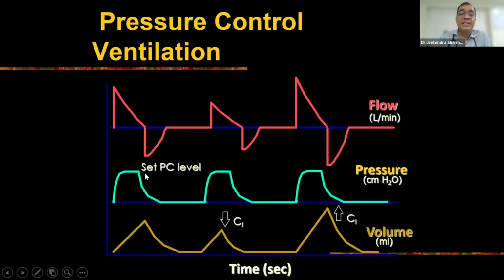And pressure is the limit. And inspiratory time will determine how much volume has to be given. You understood? If I give the command to this, my airway pressure increases from 5 to 15. Okay. The ventilator understood: 5 is the PEEP and then 15. Now, how long should this 15 remain? 0.1 second, 0.2 second, 0.3 second, 0.8 second, 1 second, one has to tell the ventilator. So we tell either in the form of inspiratory time directly, or indirectly through respiratory rate with IE ratio.